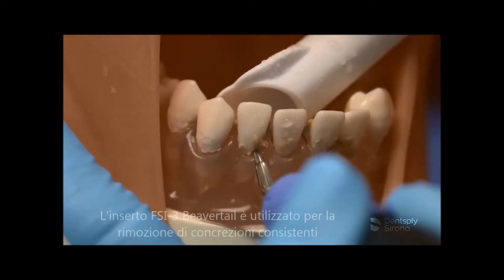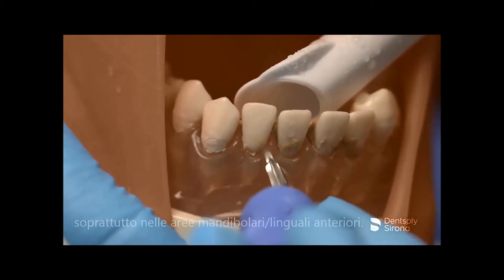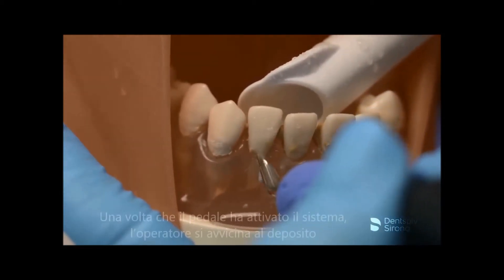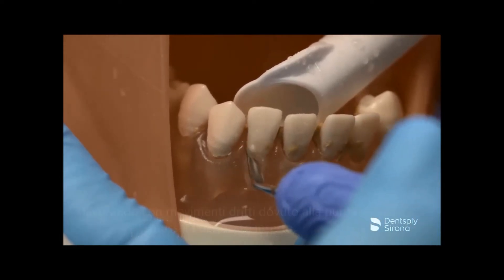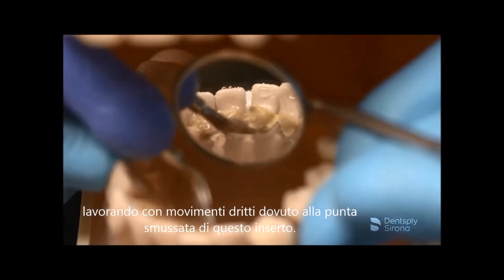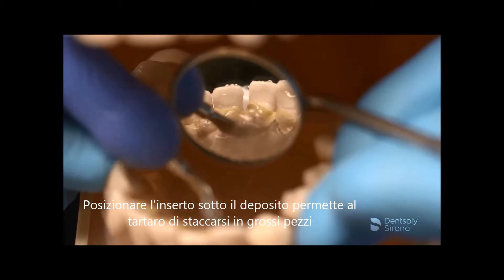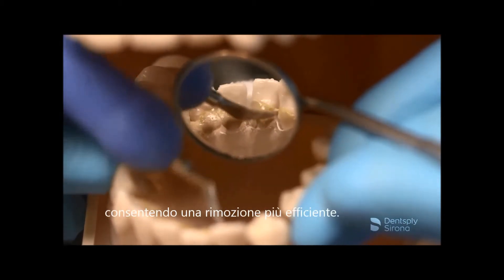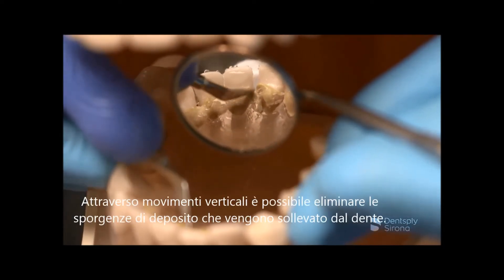The number 3 beaver tail will be demonstrated on the mandibular anterior region. The beaver tail insert is utilized for the removal of heavy deposits in this area. Once the foot pedal is activated, the clinician approaches the deposit in more of a straight-on approach due to the blunted tip of this insert. Adapting the insert under the deposit allows the calculus to break free in large pieces allowing for more efficient removal. There is a slight vertical stroke when a ledge of calculus is lifted from the tooth.